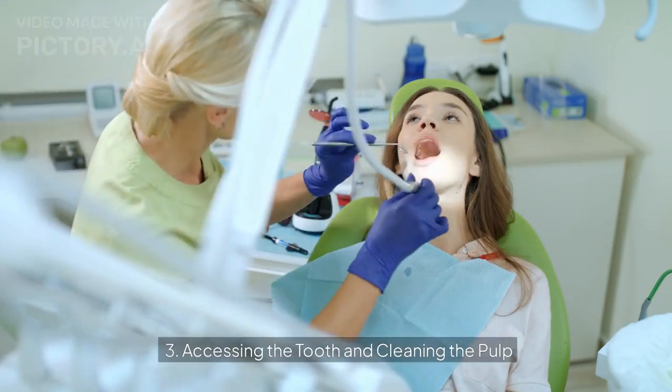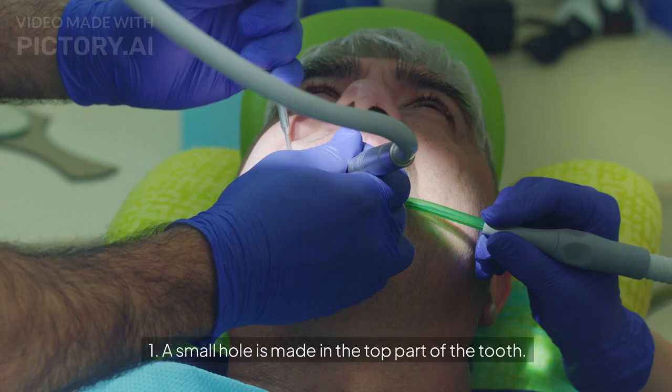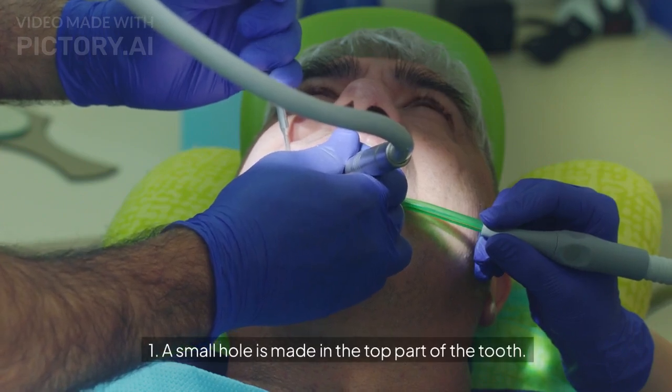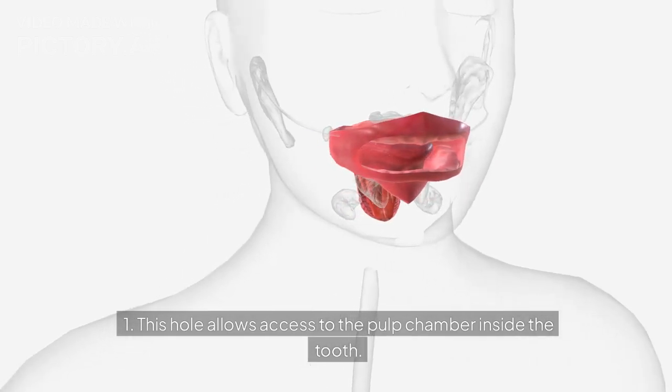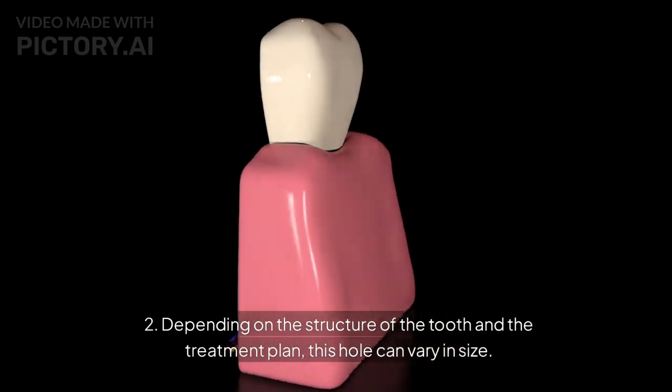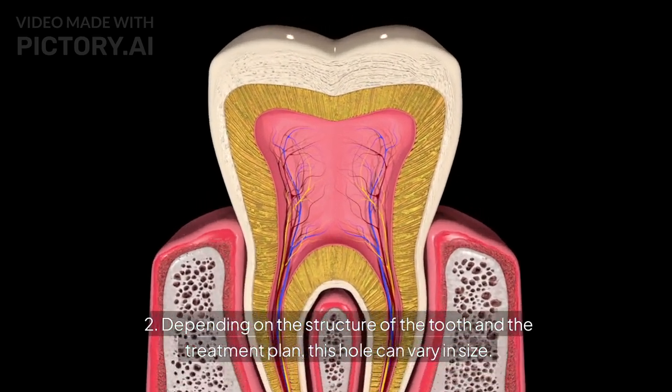3. Accessing the tooth and cleaning the pulp. Creating an opening in the tooth. A small hole is made in the top part of the tooth. This hole allows access to the pulp chamber inside the tooth. Depending on the structure of the tooth and the treatment plan, this hole can vary in size.